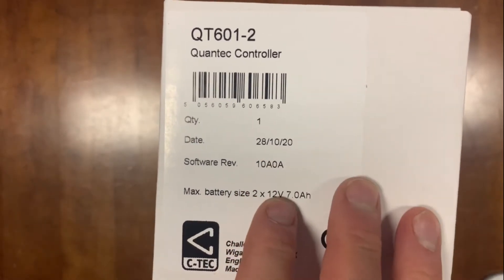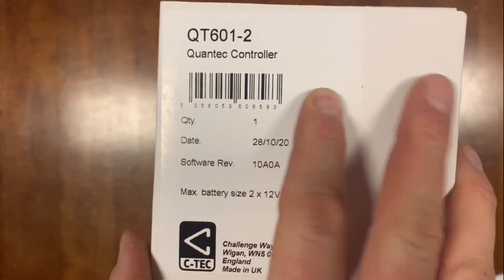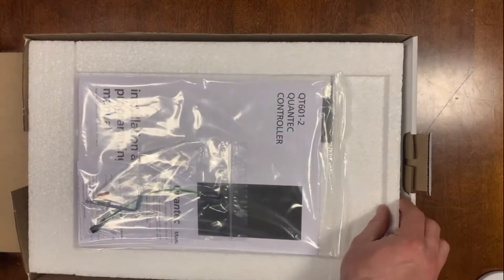I'll take a quick look at what's in the box with the Quantec QT601-2 Quantec controller. This is CTEC's addressable nurse call system. We have all the different components and everything you need for a complete system here, also available on the website.